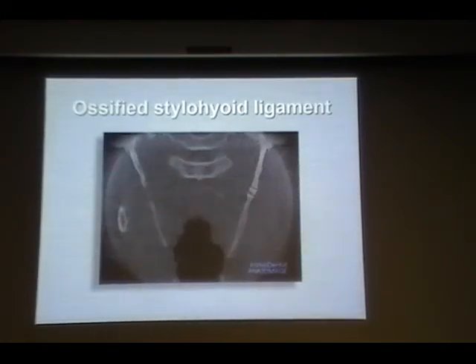So here is an exaggerated example, you can see the ossified structure. Again, as soon as you see this, please don't call the patient as having Eagle syndrome. No.